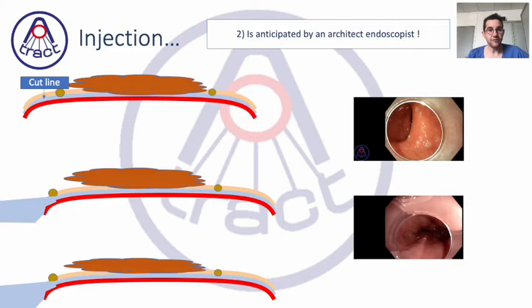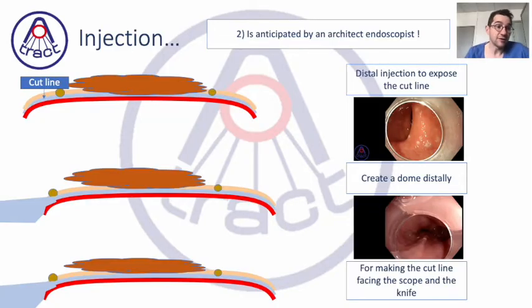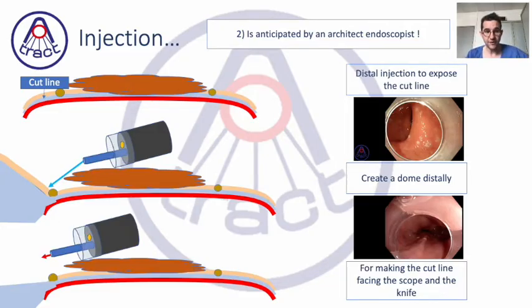Next case, if you have a difficult lesion, for example in the right colon, and the area is difficult to reach on the oral side, you will inject first at the oral side. I mean, if you want to create an elevation facing you for the distal point of the lesion, you will inject first far from the lesion, outside the dots, to create this mountain facing you.